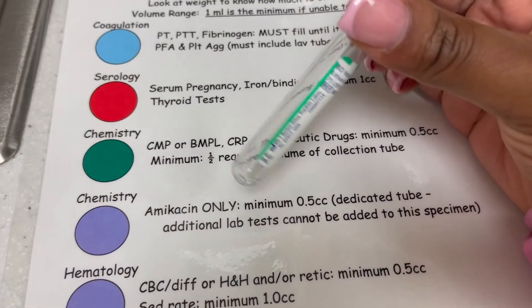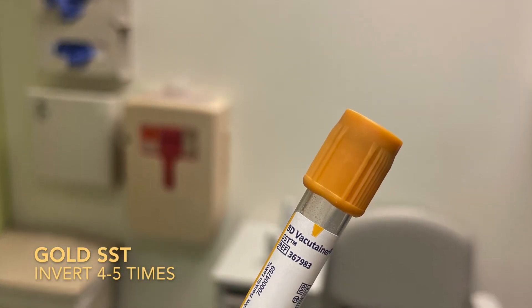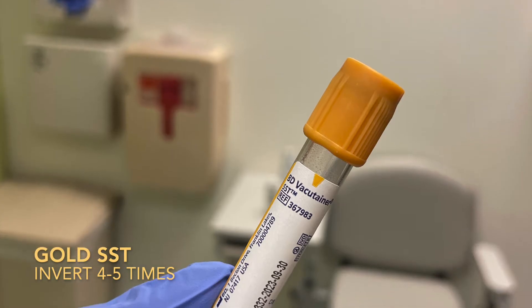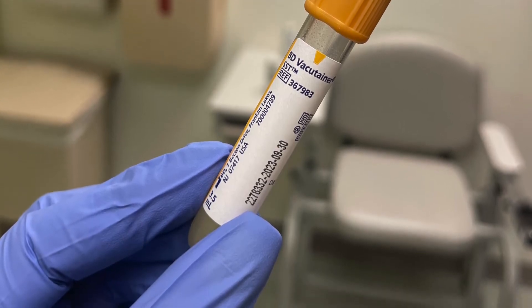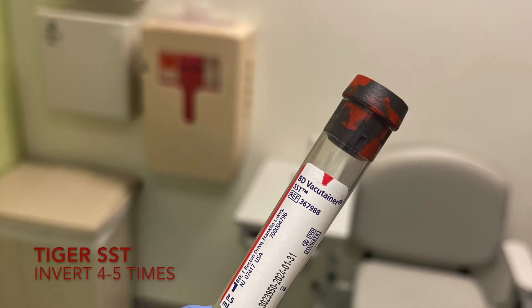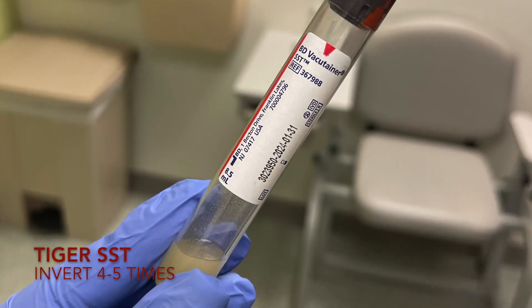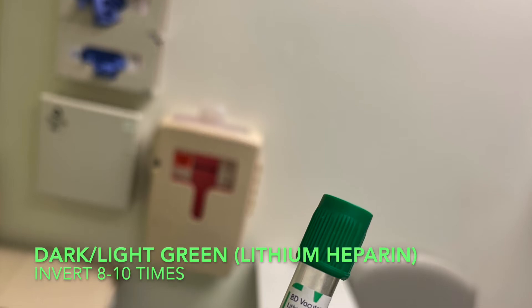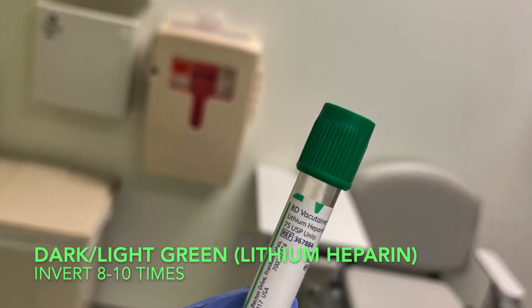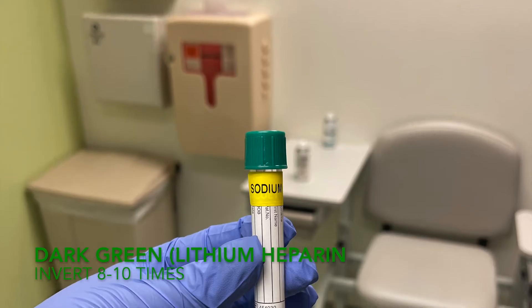Chemistry — meaning a CMP, BMP, and testing medicines — has multiple vials in this department. You will have an SST, a lithium heparin, and a sodium heparin. SSTs are always collected first before the green tops, whether it's a gold or tiger top. After the SST, it's going to be the lithium heparin, which can be a light green or dark green. Tests for this include CMP, PTH, ionized calcium, magnesium, phosphorus, and CRP.